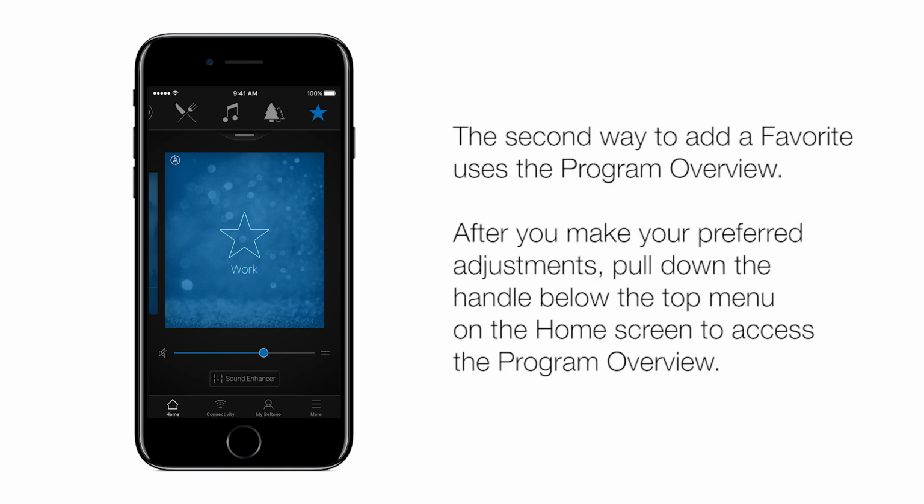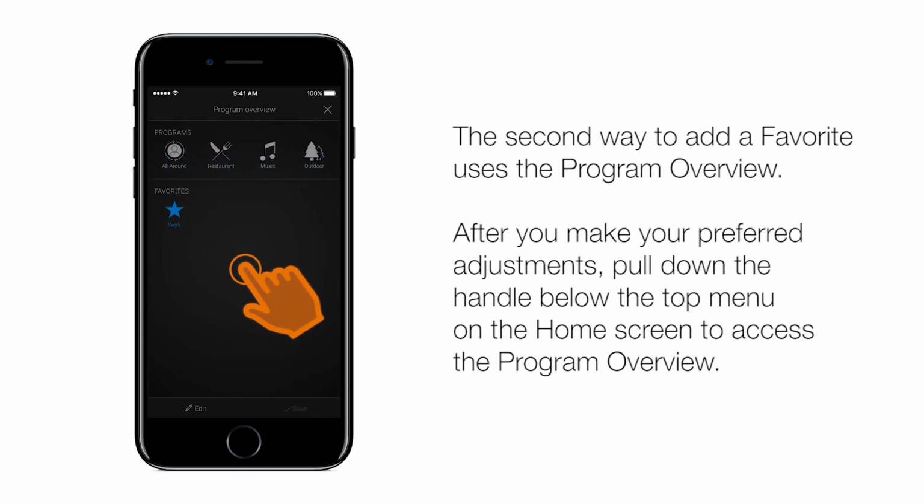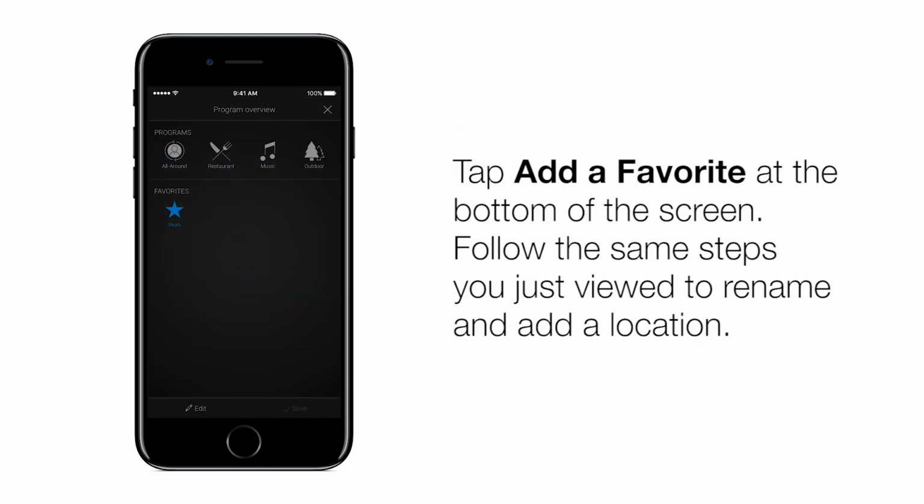The second way to add a favorite uses the program overview. After you make your preferred adjustments, pull down the handle below the top menu on the home screen to access the program overview. A finger drags down the horizontal handle in the center of the screen below the top menu.